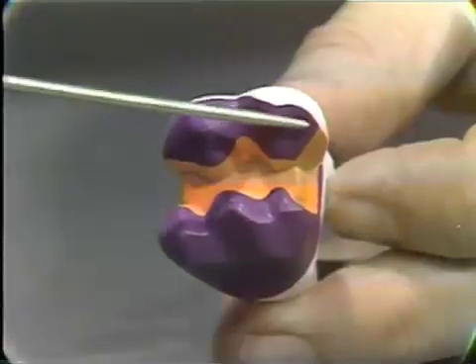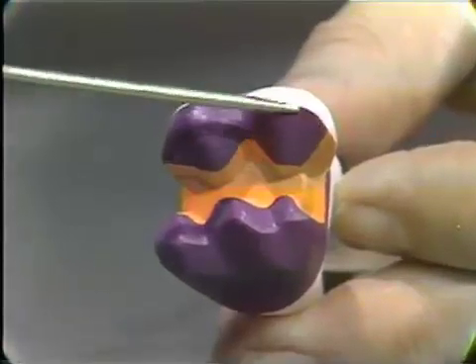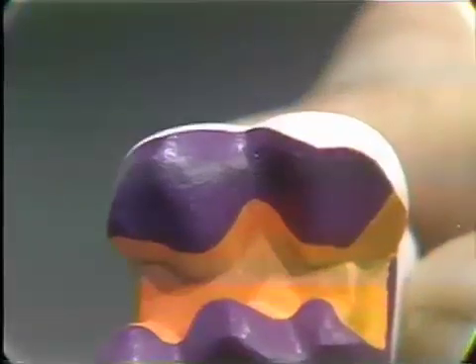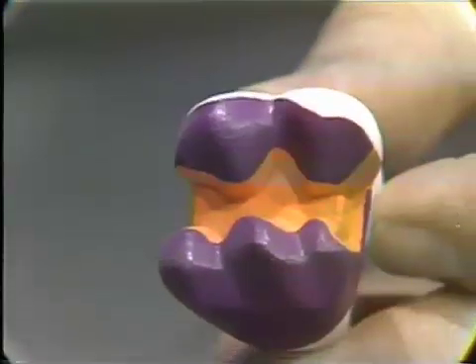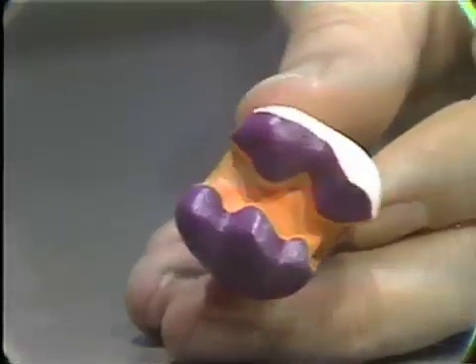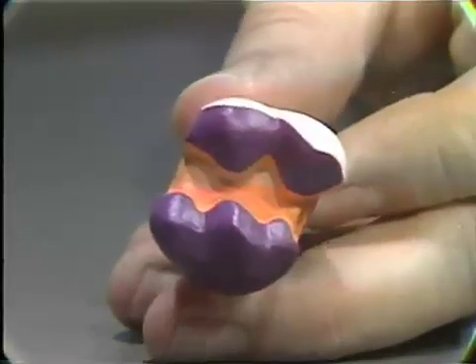You can see the amount of occlusal protection here, again, is kept minimal on the mesial cusp and becomes a little bit more extensive on the distal. And obviously this can be modified according to the particular tooth and the strength of the remaining tooth substance. You can make it greater or lesser than this according to the particular situation. So that then is the three-quarter crown of the box type on a molar tooth.